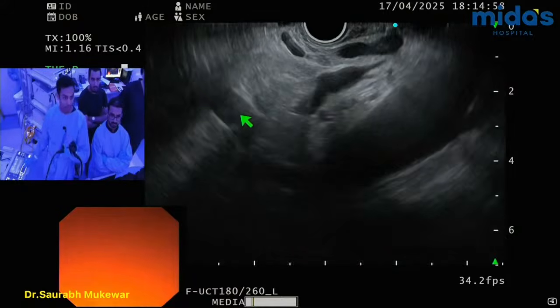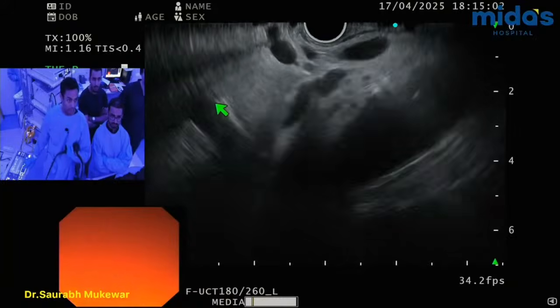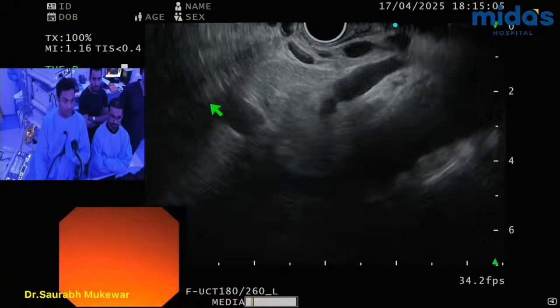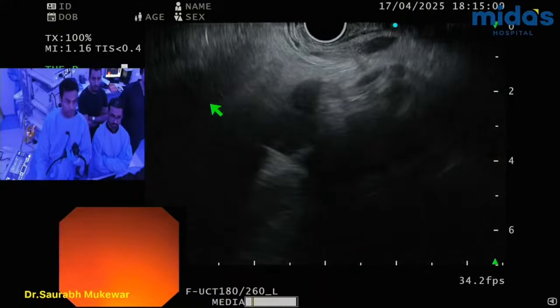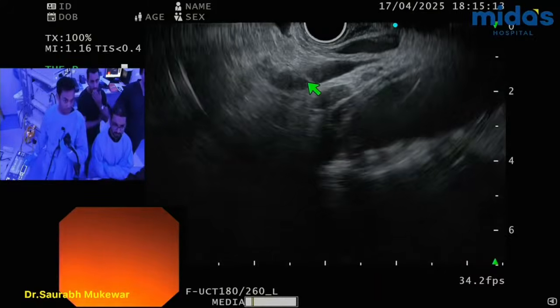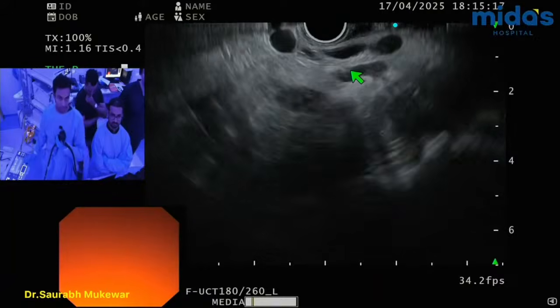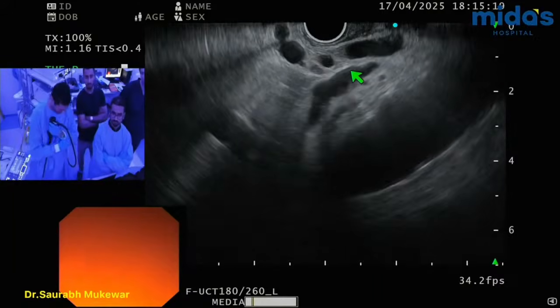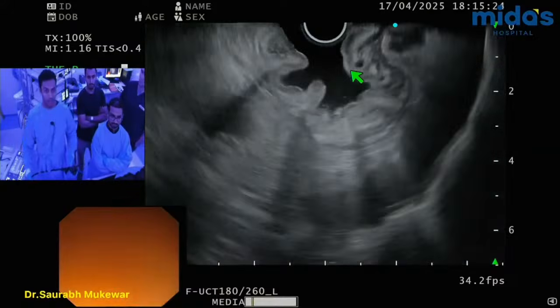So this is the renal vein from the left kidney, and then we can trace this out right there, and then from here is that outflow tract. So it's a gastro-renal outflow from here. And we confirm that again. Okay, cool. Okay, so let's see now.